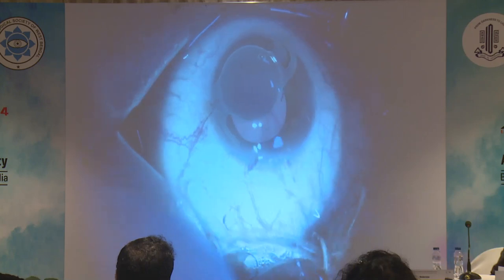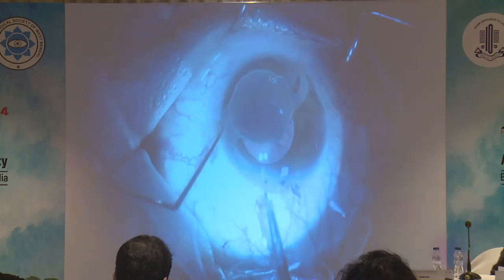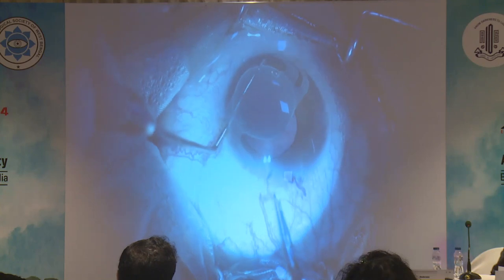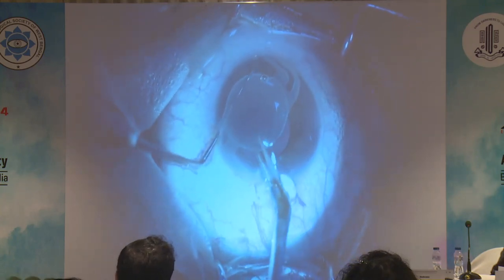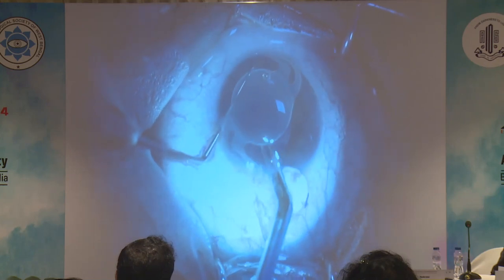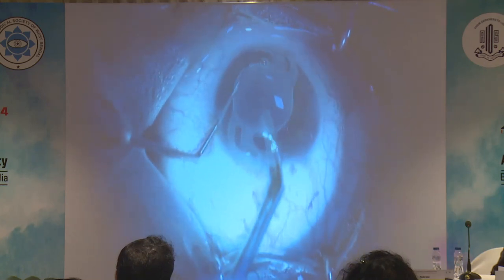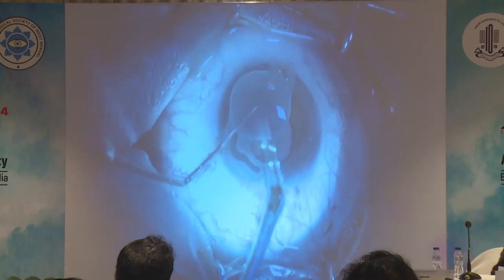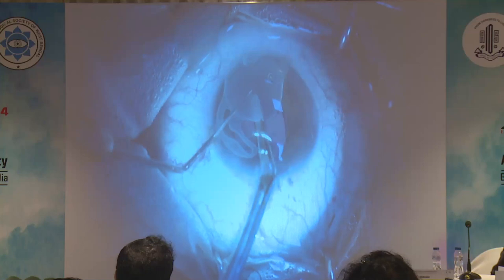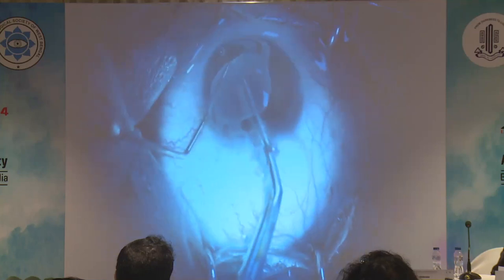Then I take a dialer and a Vannas scissors to cut this opacified IOL into 2 pieces. I try to support the IOL with the dialer while cutting it.